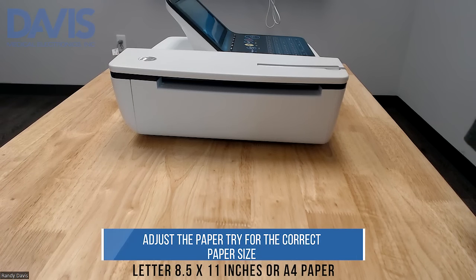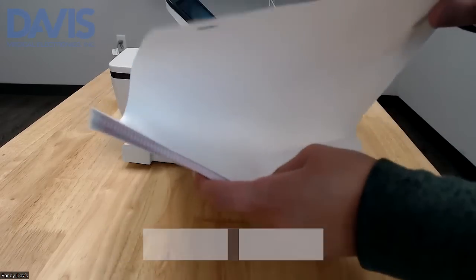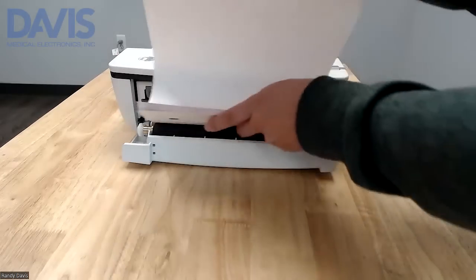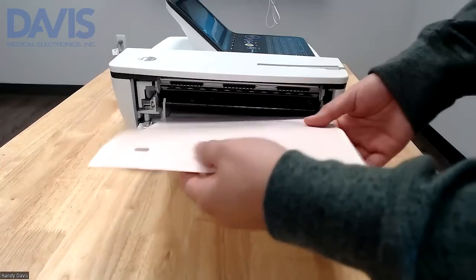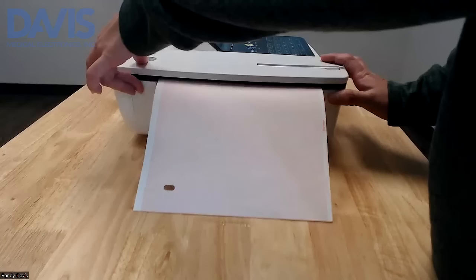To replace the paper, press the button on top of the system. Feed a pack of paper through with one sheet out. Make sure that the sensor is on the top left corner. Close the door until it clicks in place.